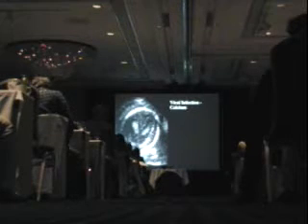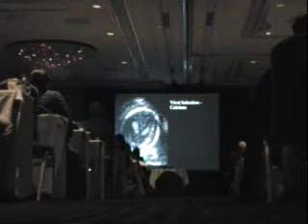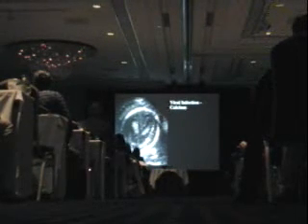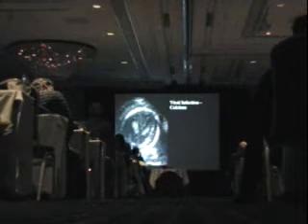Here's another viral infection. This was sort of interesting. This is transabdominally in a rather heavy lady. You could see the deposits of calcium, but it was not periventricular. It was a little further deep in the brain.